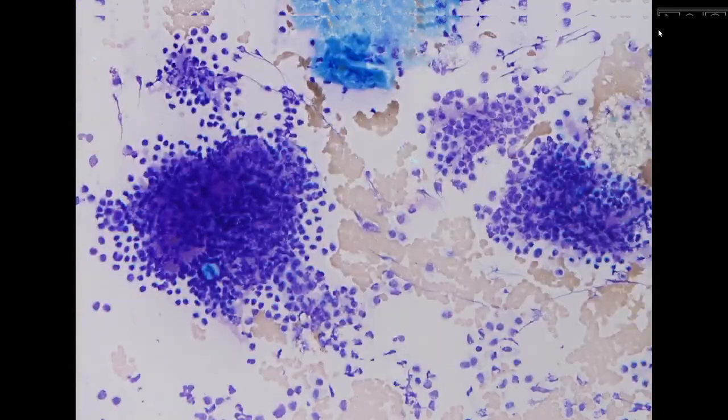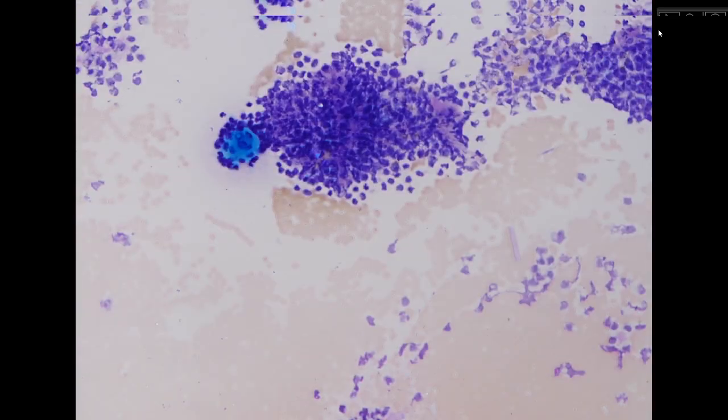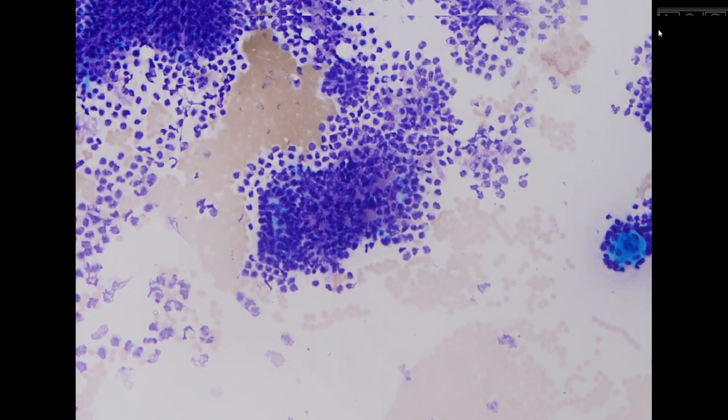This is coming from a 70-something-year-old female, so likely she would not want to have a surgery for this. So finally, I decided instead to call this SUMP. It's reasonable to call it SUMP basaloid subtype, but maybe we should just call this benign pleomorphic adenoma. Okay, so we have these good features suggesting it's likely to be a pleomorphic adenoma, so we would sign it out as such.